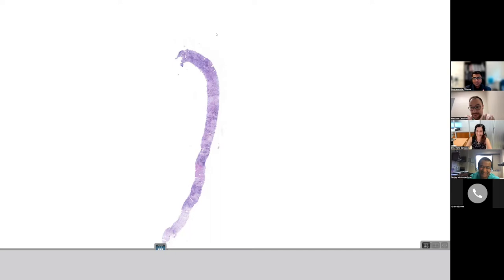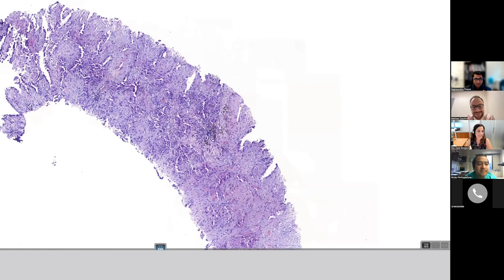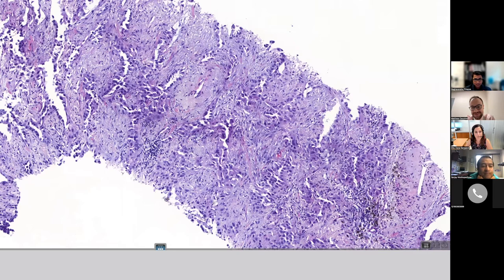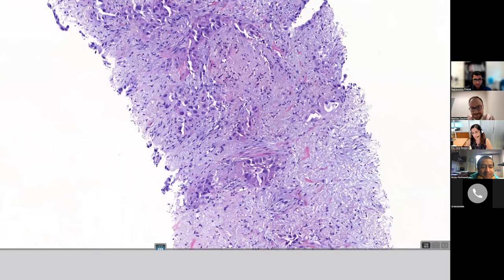Not others. So here we have this biopsy, where we can see these atypical cells that, in my opinion, here are in normal parenchyma maybe, but here we can see some desmoplasia, or maybe we see desmoplasia everywhere, and this looks like malignant glands, gland forming, in my opinion. Agree. Also, yes, clearly malignant adenocarcinoma.